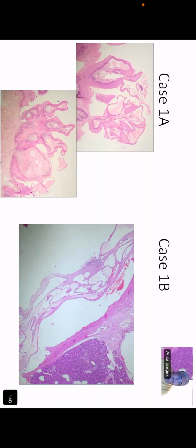There are numerous cystically dilated spaces, some of them filling the entire stromal content of that exophytic squamous lesion. Isn't that so? Yes, ma'am. So this is not a true papilla, because if you make the mistake of just calling it a papillary lesion, you may come to the wrong conclusion.